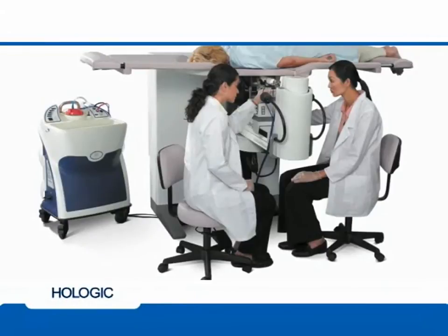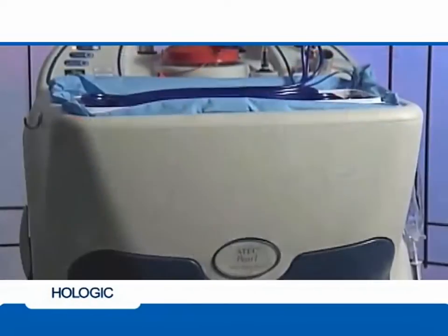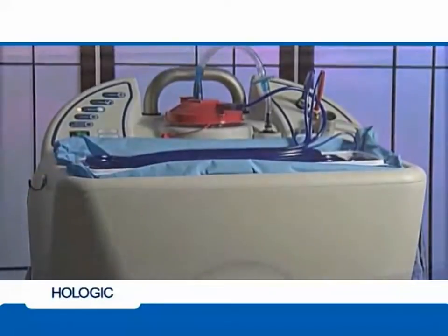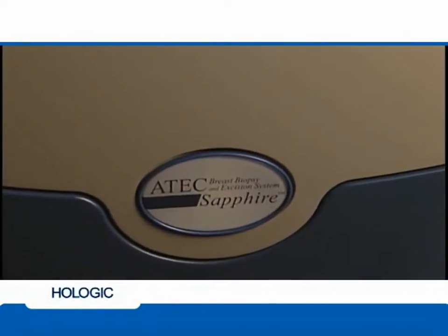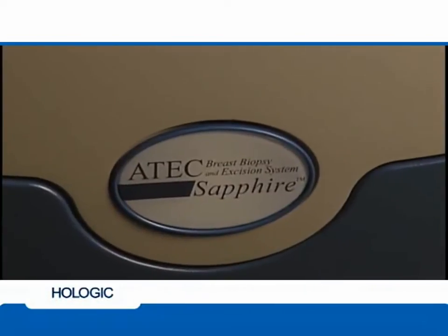Stereotactic guided breast biopsy is designed to calculate the exact location of the breast abnormality. Calcifications and masses are examples of the types of abnormalities that can be biopsied using stereotactic guidance. The Suros ATEC Pearl and ATEC Sapphire breast biopsy systems are compatible with all major prone and upright stereotactic systems.